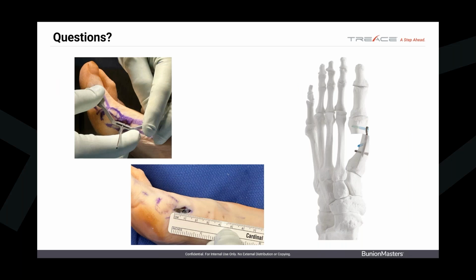I found an easy way to control bleeding is to just Trendelenburg the foot 30 degrees. We used to have a bloodbath at times doing these procedures in the normal flat position. And then when we started putting them at a 30-degree Trendelenburg, we had minimal to none. So feel comfortable that this procedure and all MIS procedures in general can be done without a tourniquet. And it has changed my approach to foot surgery in general. I very rarely use a tourniquet even for reconstructive cases anymore. We're so comfortable with the small amount of bleeding and the good dissection. So you don't need a tourniquet. Just set yourself up in the environment to minimize blood loss.